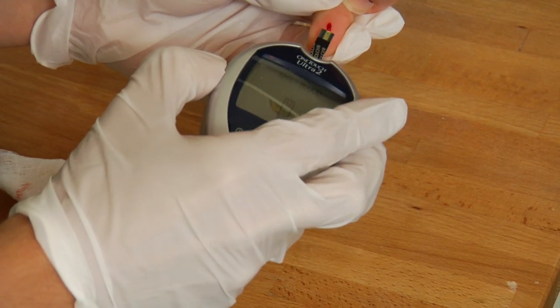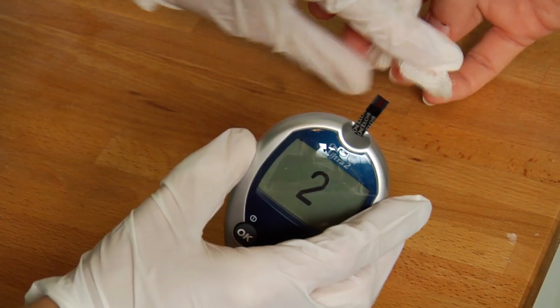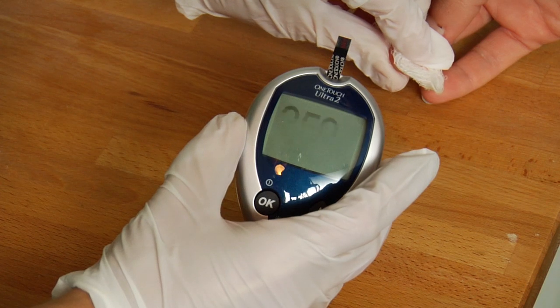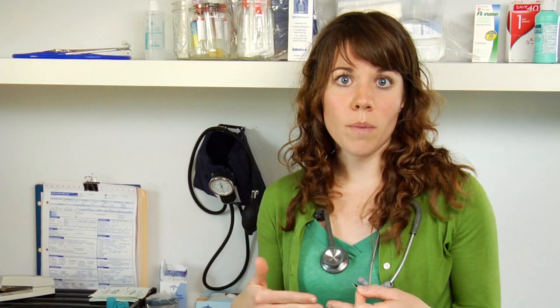The current is going to be picked up within the monitor. There is a device in there that has an electrochemical cell. This picks up the current and it produces the results of what the blood glucose level is. So it's those two components — the glucose oxidase enzyme and then the electrochemical cell within the device — that is producing the result.